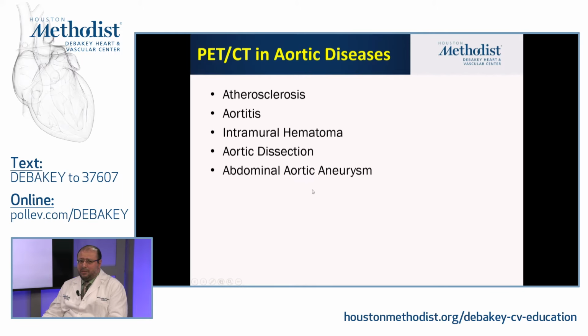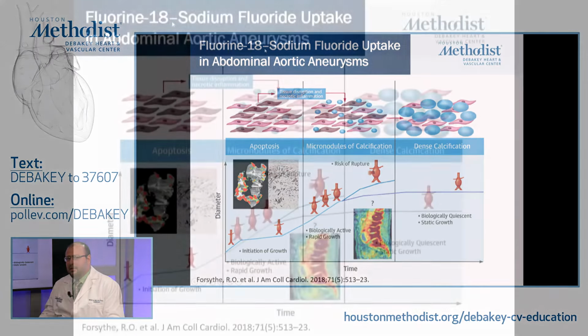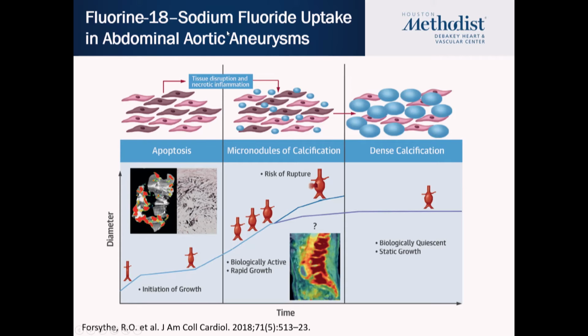So recently the group from Edinburgh, Scotland, has suggested maybe we should use a new tracer called 18F sodium fluoride. This one is a tracer that's almost always used for prostate cancer. Our colleagues across the street and other oncologic practices use it to look at prostate cancer and whether it's invading the bone. So it does detect microcalcifications. And atherosclerosis and inflammation do involve some of these microcalcifications.